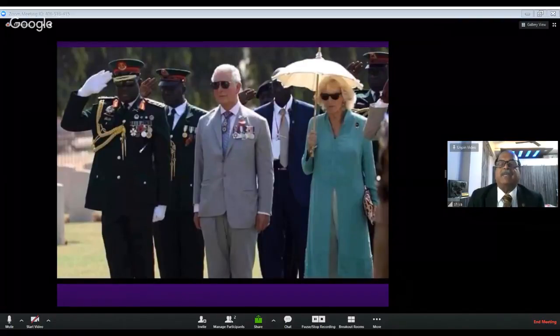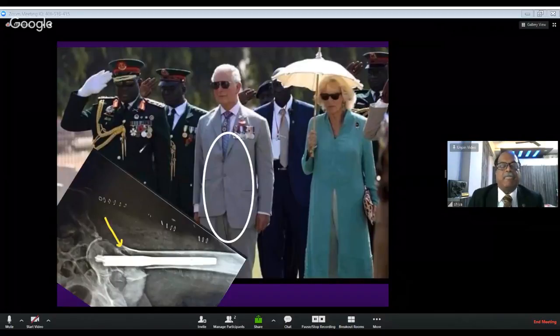It's like the first button of the shirt. If it is aligned properly, the last button also will get aligned properly. If the first button is not aligned correctly, as you can see in this picture, then automatically the last button will also not get aligned. So the first button we can compare to the anterior cortex, and the last button we can compare to the posterior cortex. So always put the anterior cortex, the first button, properly, then everything will fall back in position. Even experts fail sometimes.